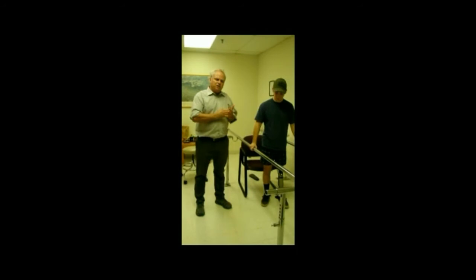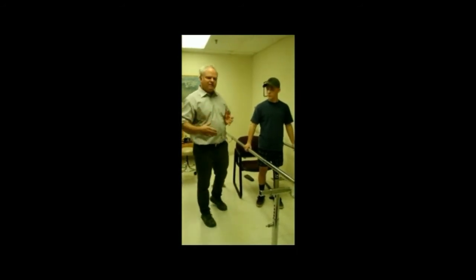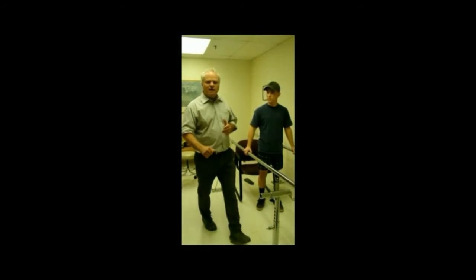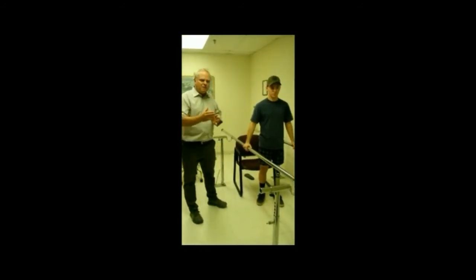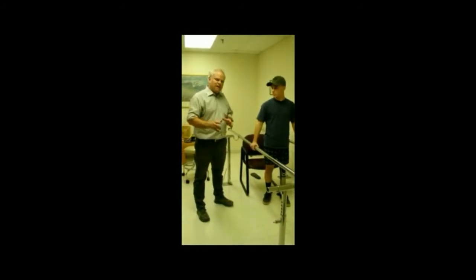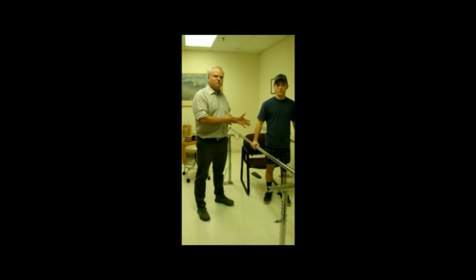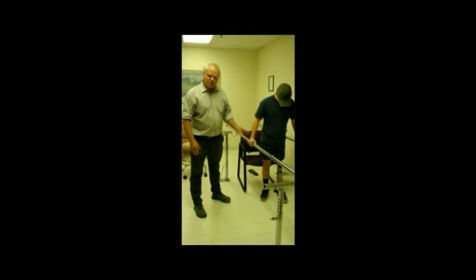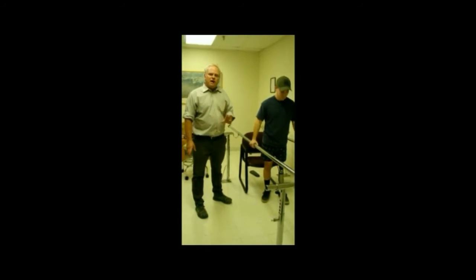If I have too much, it's too late in the gait that it releases. If it's too little, it's too early in the gait that it releases into swing. So I can tune the timing of release into swing. But I'm not doing that today because this is all new to this particular client. So anyway, test socket fittings, you should be able to do a lot of alignment with it.